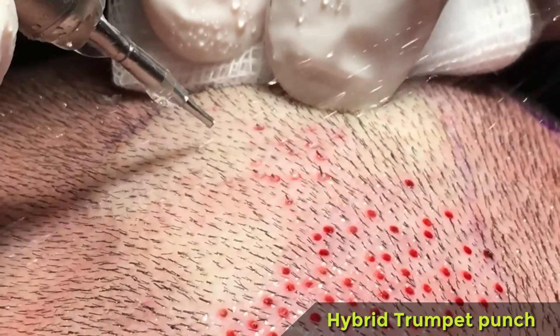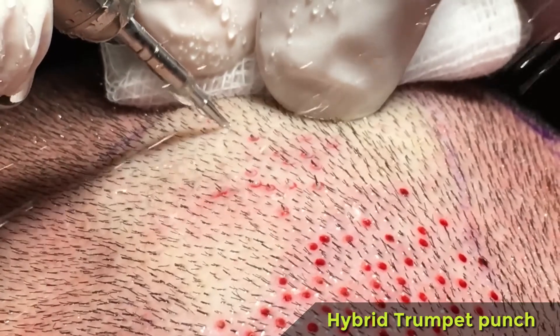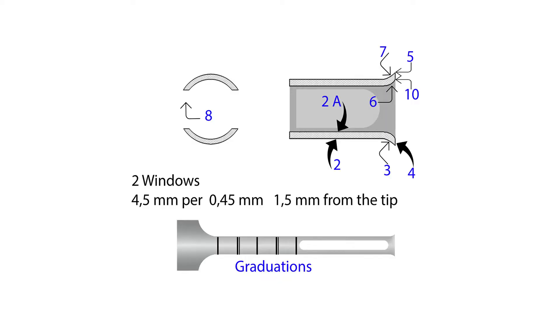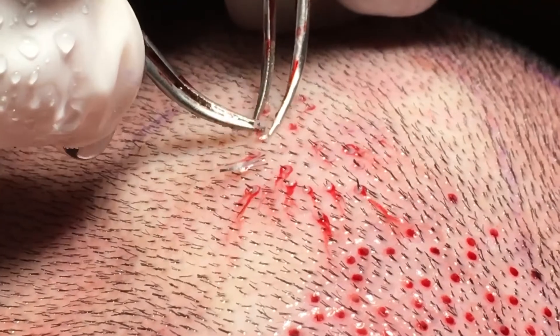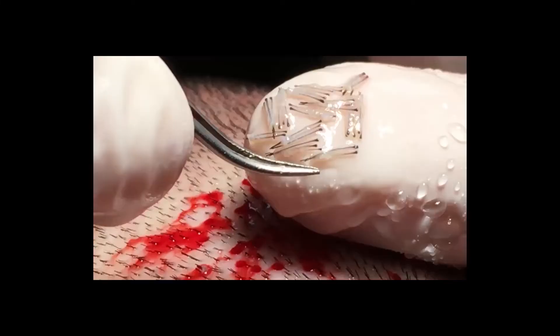When this happens, you should reduce the speed and depth, and possibly use a punch that will be available soon: an external serrated hybrid punch with small apertures that will reduce friction between the punch and the follicular unit as much as possible.